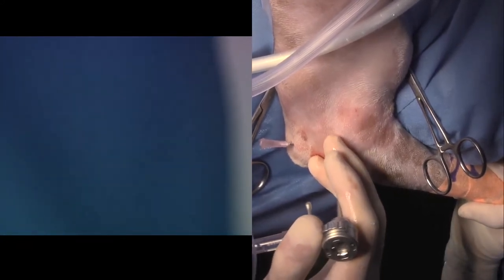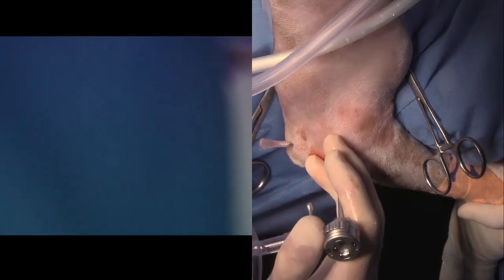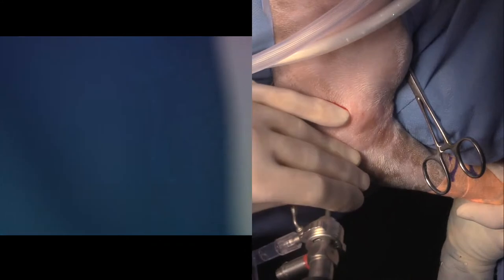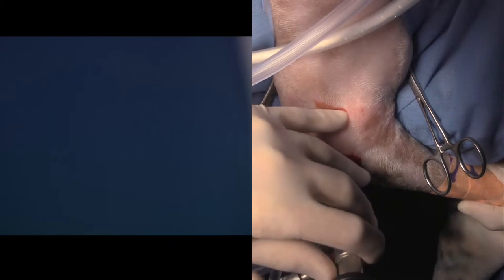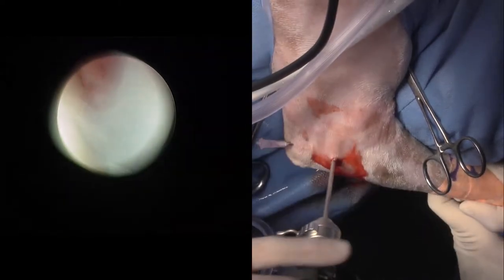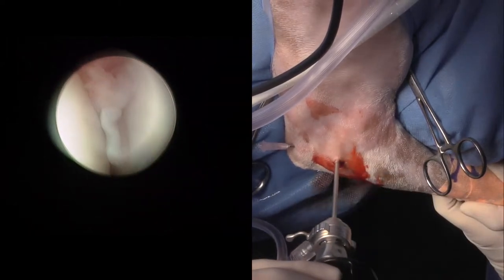Now, I might try to zoom out a little bit so you can get a better image of what's going on there. All right, so now I'll put my scope in. Can you turn anti-clockwise very gently and then just pull it straight out? That's it. I'm putting a telescope on, attaching our light guide, turning on the fluid or the flush, and that's coming out through the egress needle nicely. And I can tell that we're in the joint here.